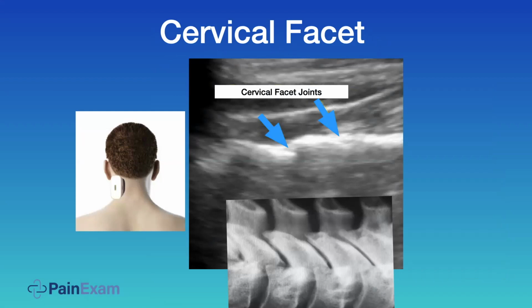I find it to be more painful for the patient, and I've seen more vasovagal reactions than when I do the medial branch. As a just FYI, the way I do these shots is I have the patient sitting up, hence the big issue with the vasovagal. You don't want anyone fainting. And their neck is flexed. With this approach, I found it just to be too painful.